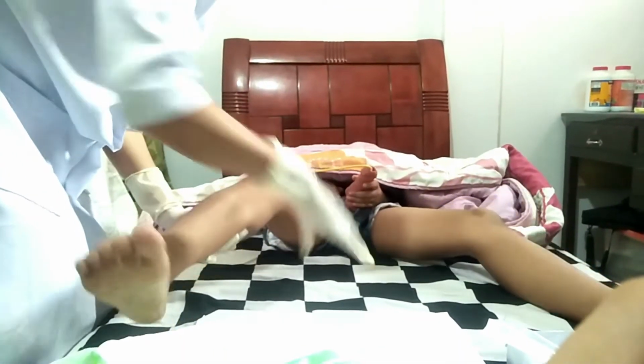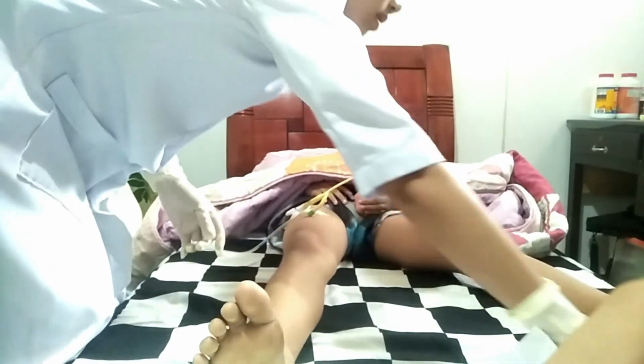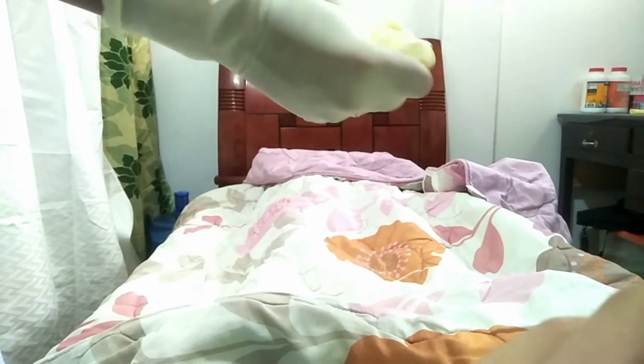So let's start. Sir, I'll fix your diaper. Okay sir, you can lie down. I'll gather the equipment. I'm going to discard this one.